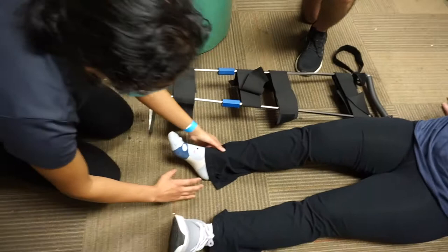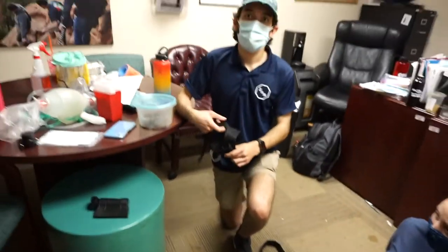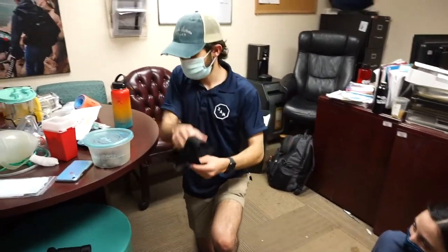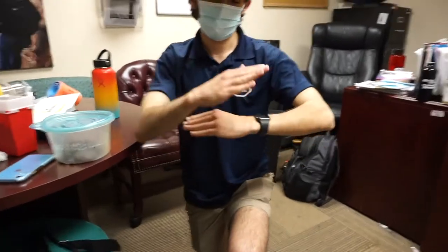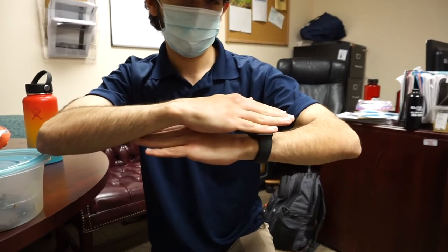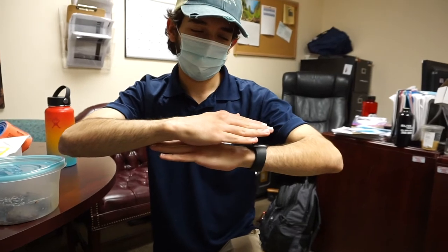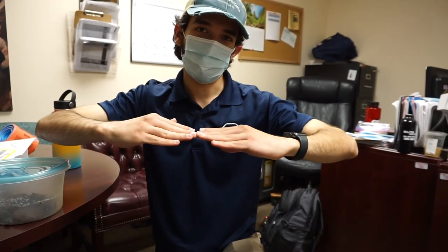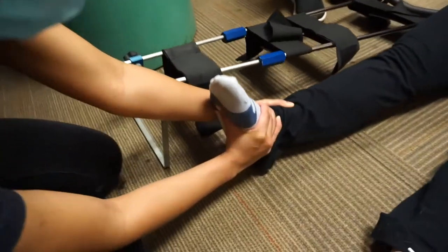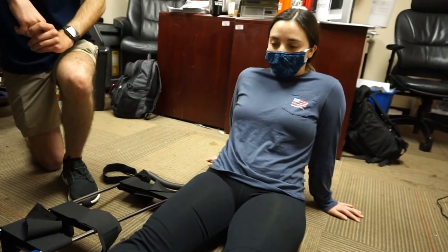Diane is going to start holding what's called manual traction. Marshall, can you demo what the femurs look like when they're stacked on top of each other? Yeah, inside the leg they could look like that — just right on top of each other. That's why the leg could be shortened. As Diane's pulling traction, she's pretty much pulling the femurs back. We're trying to reset the femur — that's ultimately the goal. We want to pull hard enough to where the pain can subside and improve.